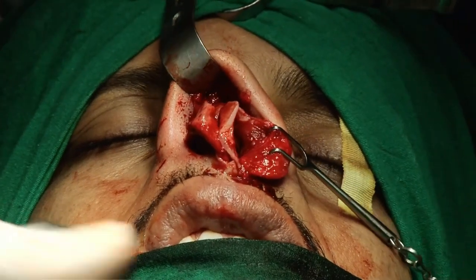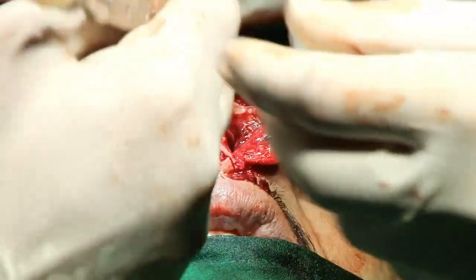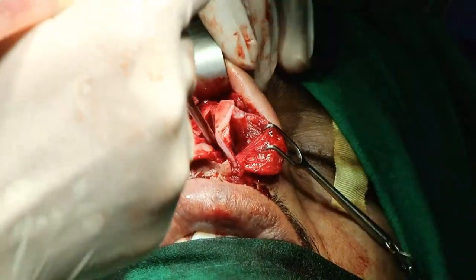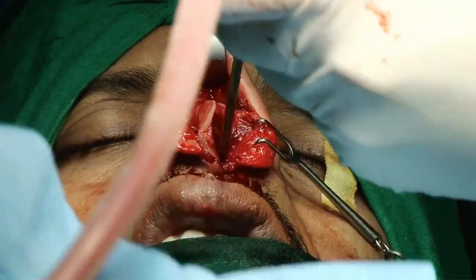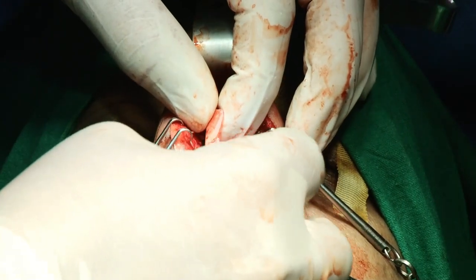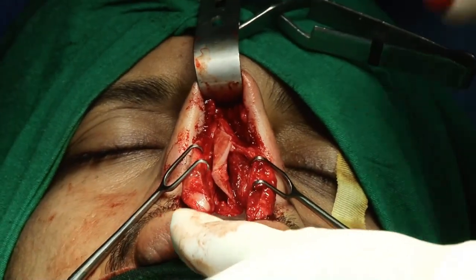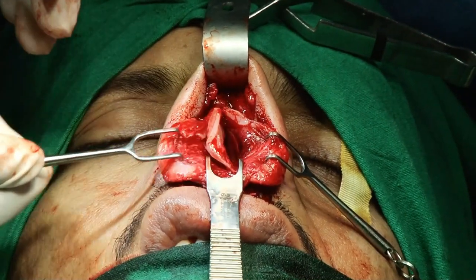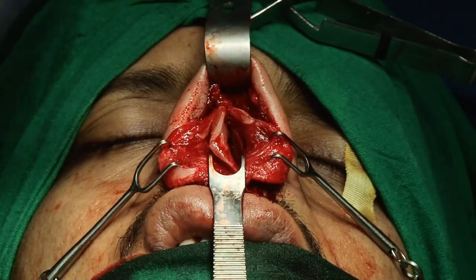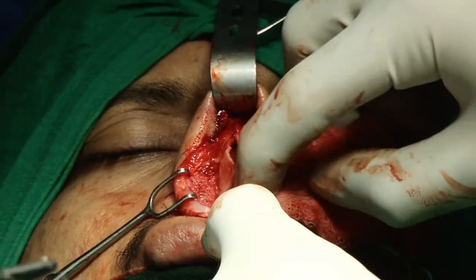So now I just fix the caudal part of the septum in the center. Why double prong retractor? Because it will allow this side. Now why double prong retractor? So we fix it first, stabilizing at least the anterior part with the anterior nasal spine.